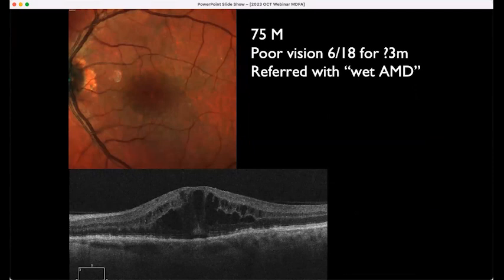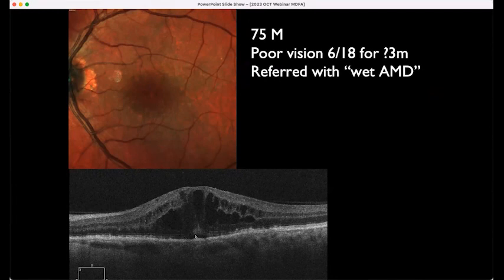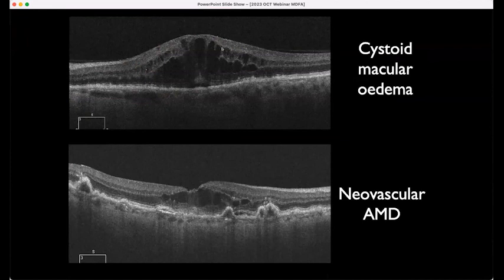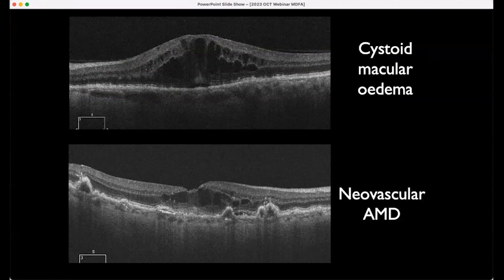This patient was sent in with 6/18 vision, referred as having wet AMD. In contrast to the VMT case, what doesn't really fit with wet AMD here is that there's only a tiny trace of fluid and it's basically all intraretinal — you're not seeing the signs of AMD. This is actually cystoid macular edema post-cataract surgery. Whereas this case does have a lot of intraretinal edema, it's about the company it keeps — there are drusinoid PEDs, subretinal fluid, and more drusinoid changes, consistent with AMD.